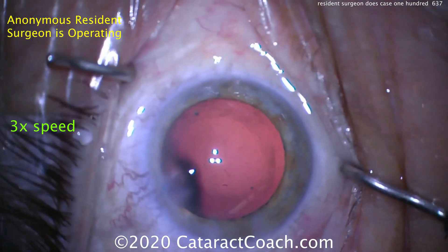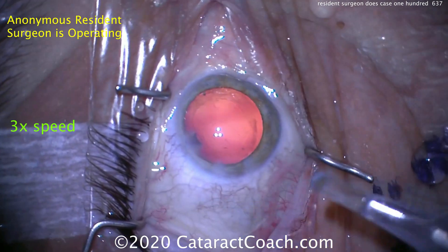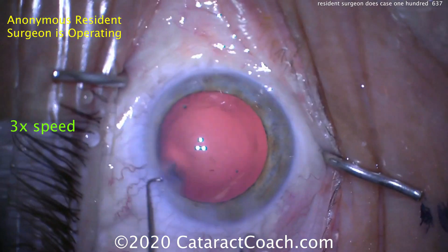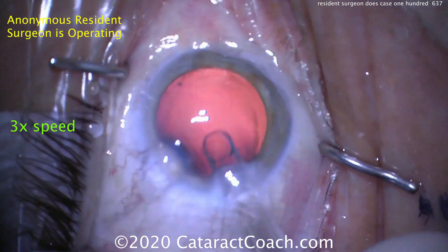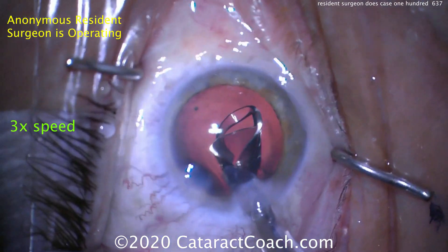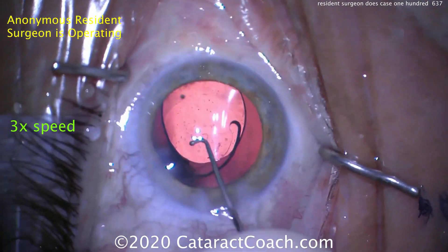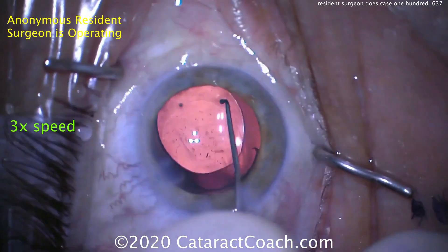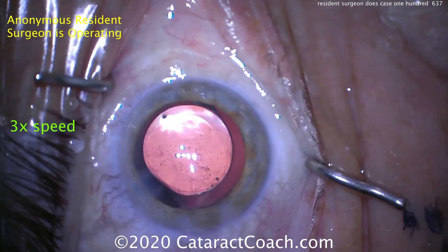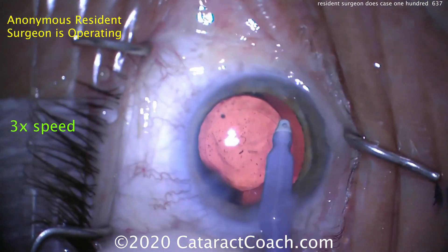The capsule bag was filled with viscoelastic. Let's see our lens decision — looks like a single piece acrylic lens going in that injector. Let's see how that's delivered. Fixating the eye — I like that technique. Delivering the lens, going in the capsule bag. Notice how the eye is staying in primary position — really good job. The resident's doing a very nice job indeed. So rotating the lens a little bit now, getting both haptics in the capsular bag. Look at the overlap of the rhexis on top of the optic — I like it. It's looking really good.